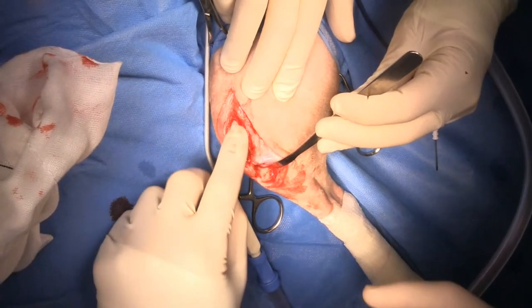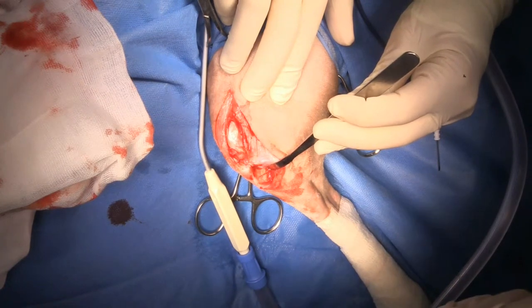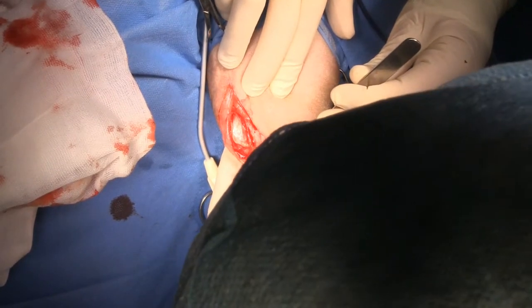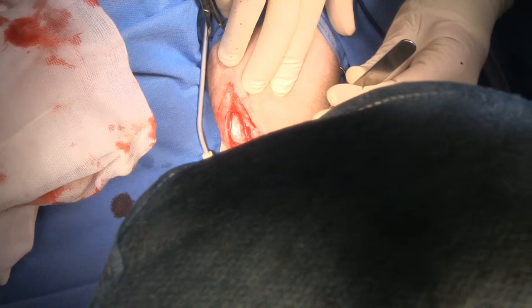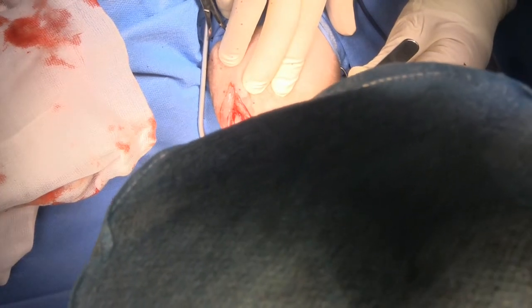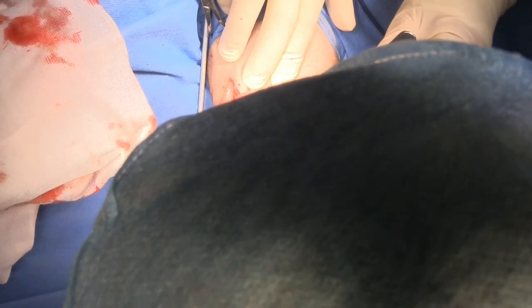You can see the condyle there and then the lateral aspect and the fossa where the cranial tibial muscle lays. One thing that people forget or don't recognize is that the articular surface is quite far caudal, so you can take a very large chunk of tibial crest. It's important that I leave the distal periosteal attachment intact because that's going to act as my tension band.